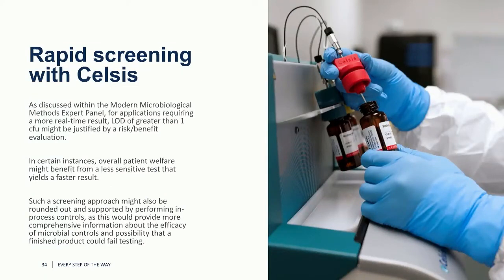And so, also to go back to the other side of the discussion here, think about whether it is worthwhile to implement a test that maybe does not have quite as sensitive an LOD and can't get down to 1 CFU, but maybe a real-time result is the more important thing, and that LOD of 1 is not as important. Of course, again, back to thinking through a risk-benefit evaluation or justification, there are situations like the examples that were mentioned by Dr. Roesti earlier in his presentation. Maybe that faster result is more imperative, and so this is doable with Celsis as well.